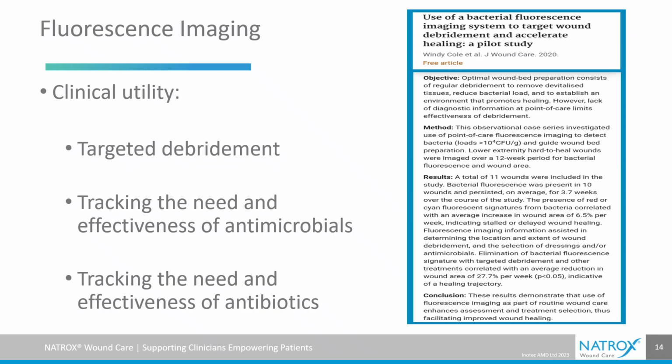Fluorescence imaging has clinical utility. I have studied this particular diagnostic image and had a publication in the Journal of Wound Care in 2020, which indicated the clinical utility for targeted debridement. It can also help in tracking the need and effectiveness of antimicrobials and track the need and effectiveness of antibiotics as well.